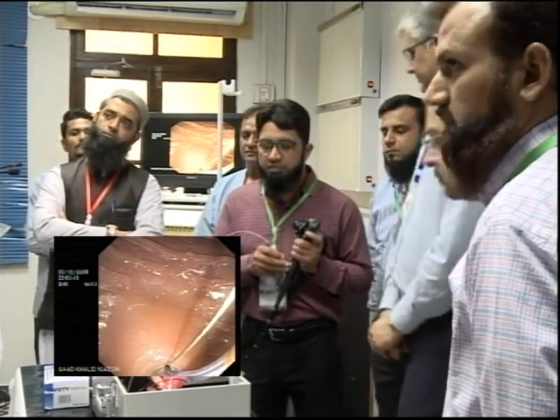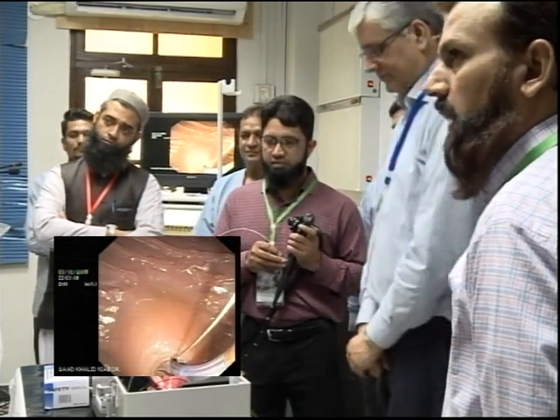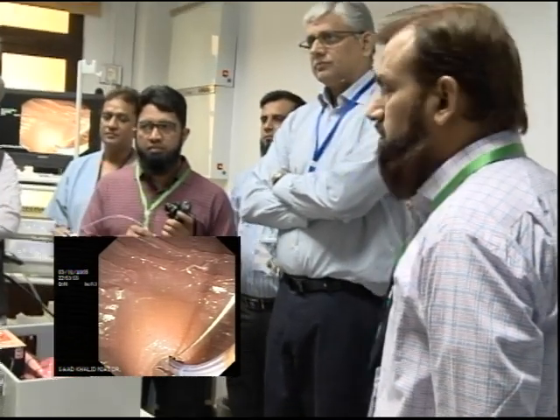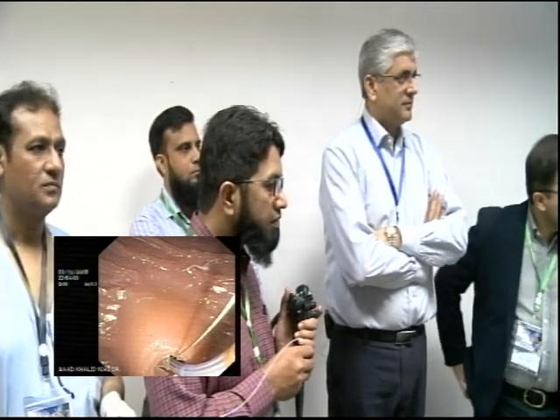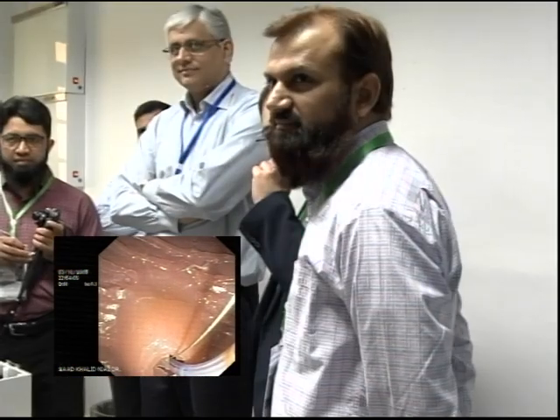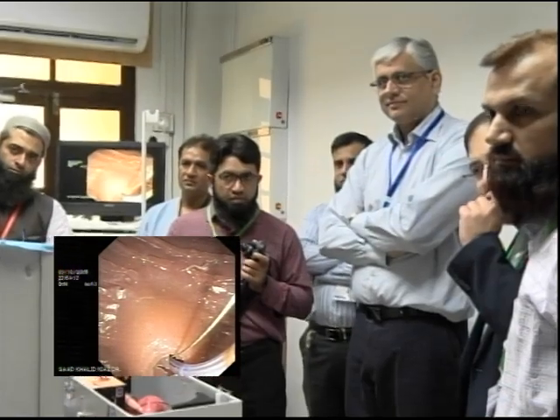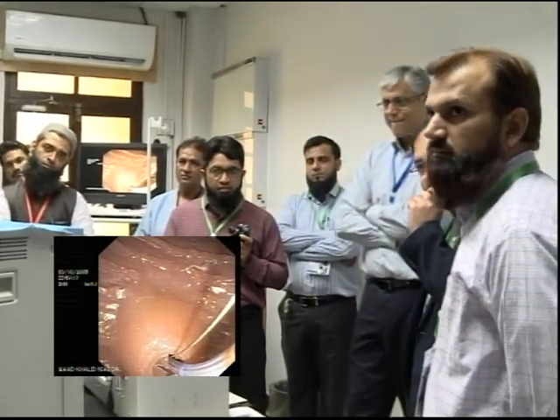Pancreas. You want to add anything, Dr.? Yeah, so you can add, I think, this is the most prominent papilla hai. As you know, normally it's not in most cases.